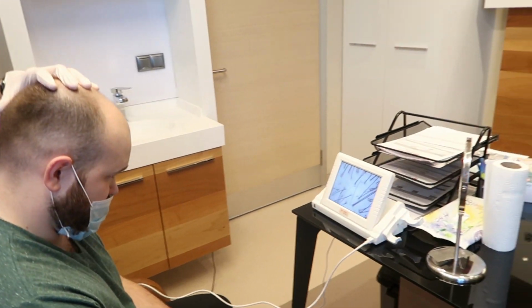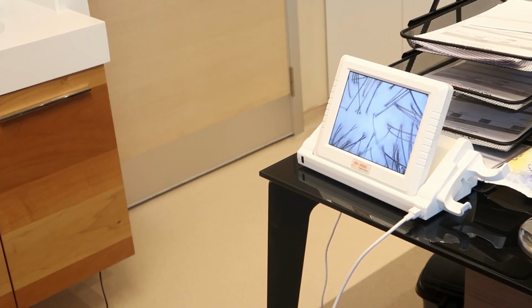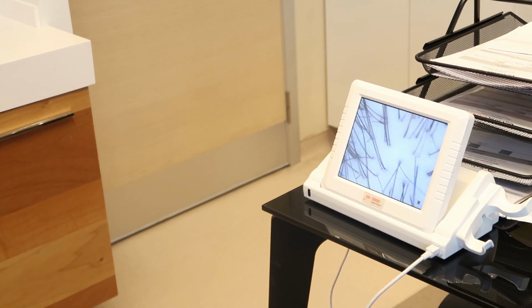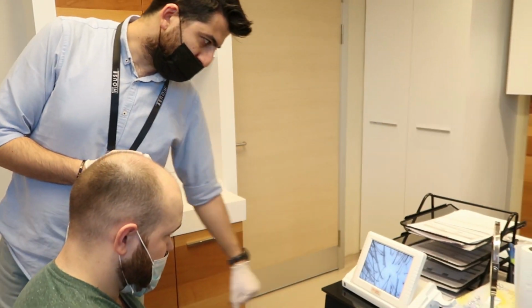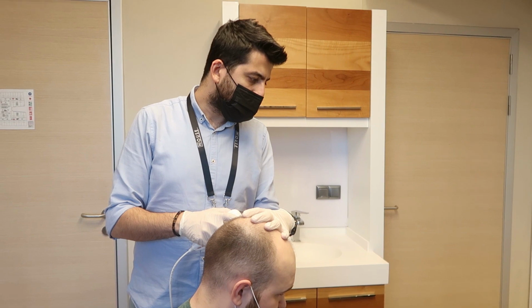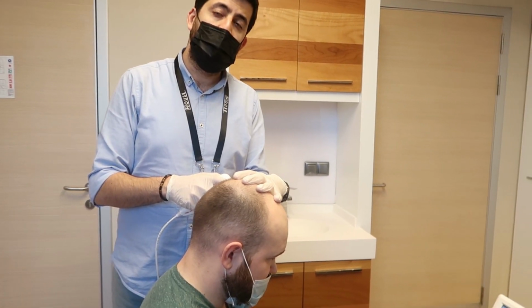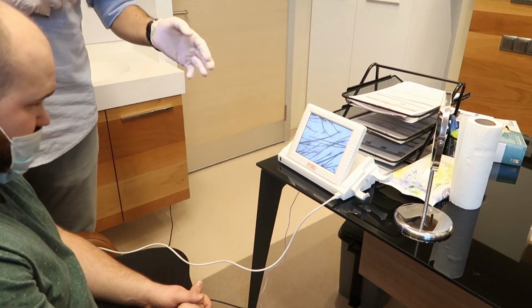It shows us like a half square centimeter area. Wow. As you see, your graft quality is generally good, the thickness as well, and the color seems good. You have some double grafts like that, some triple grafts like that. It's good news for us. Do you think his hair color will be the same as the back? Yeah, exactly, the color won't change after the transplantation.